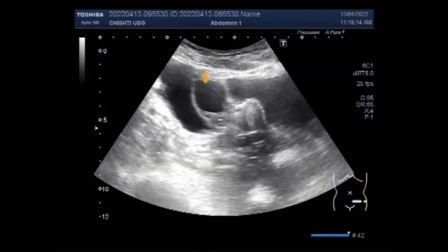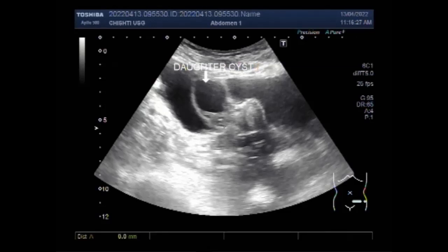Now you can see clearly the daughter cyst. While most cysts do not cause symptoms, if a cyst ruptures you will feel sudden pain and discomfort. If you have been diagnosed with an ovarian cyst and are trying to get pregnant, it is important to know that ovarian cysts do not typically cause problems with fertility. However, there are always exceptions to this rule.